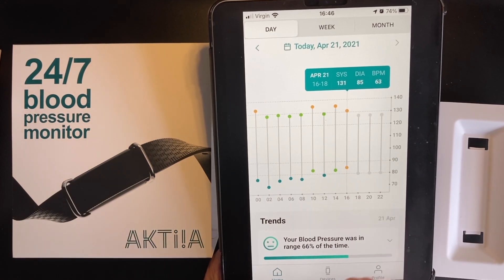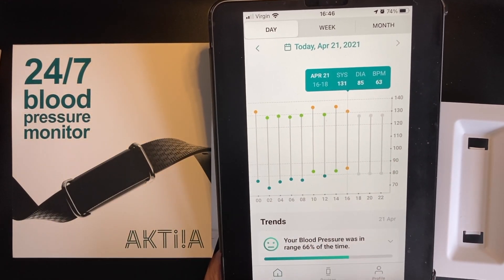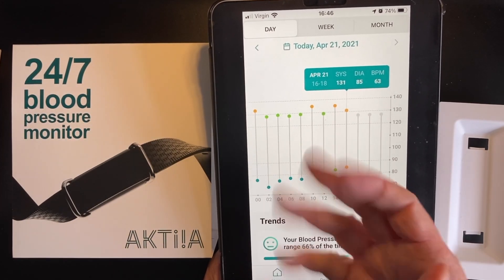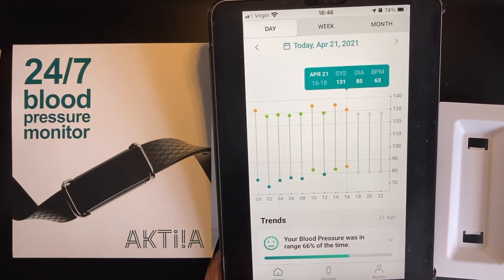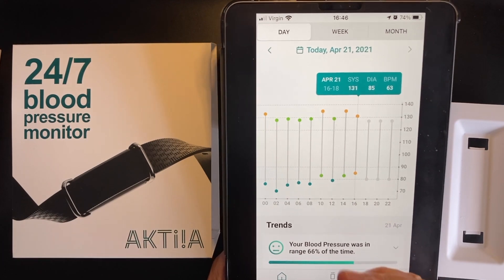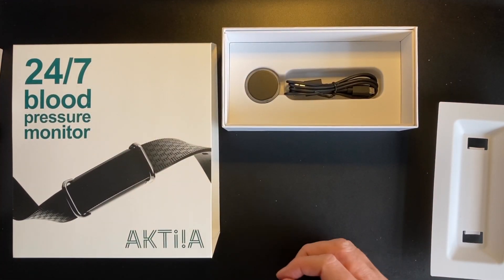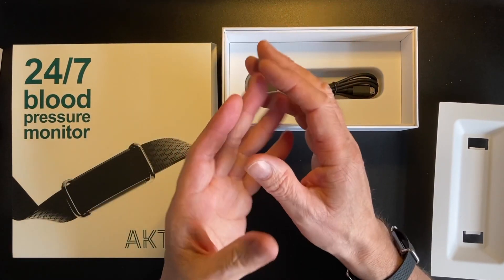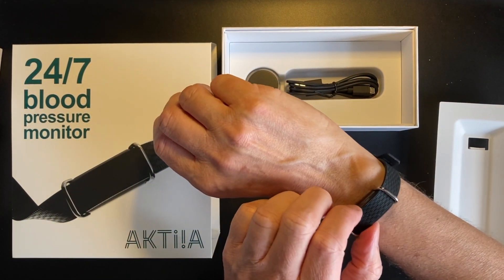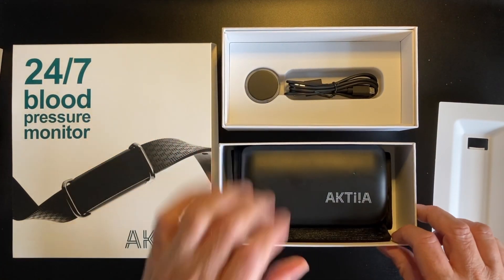All of this is in the app. All you have to do is periodically throughout the day synchronize your data by pulling up the app on your iPhone or smartphone, pulling down to sync, and it synchronizes the device. That data is then aggregated in Actia's cloud and produces this data output. Configuration was really simple — you just download the app, synchronize and pair the device, and take an initial reading with the blood pressure cuff.